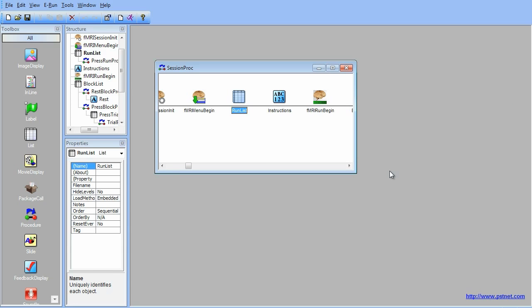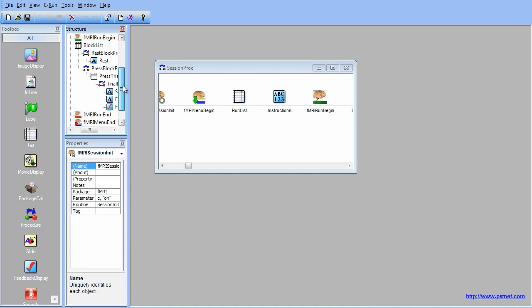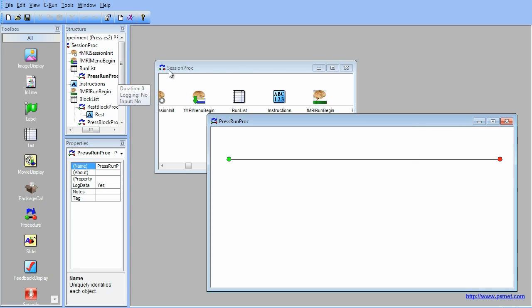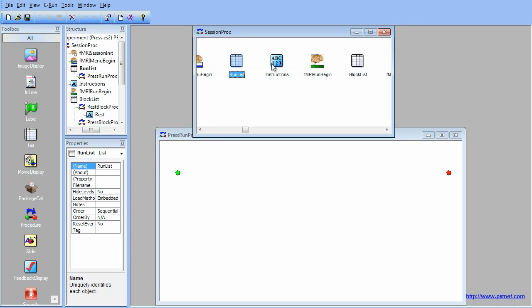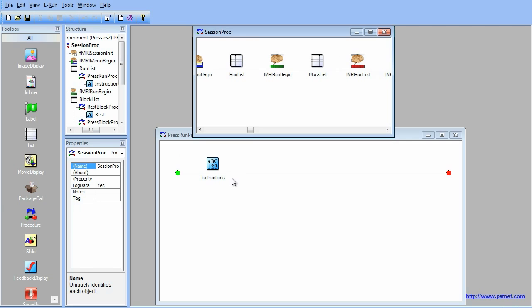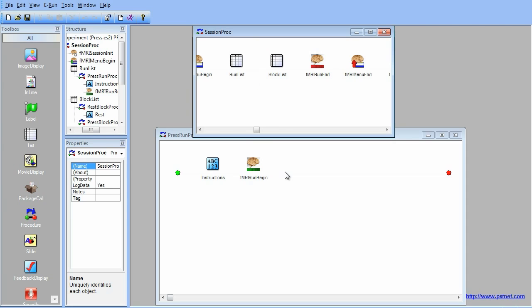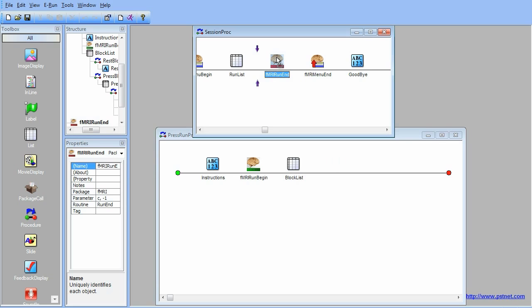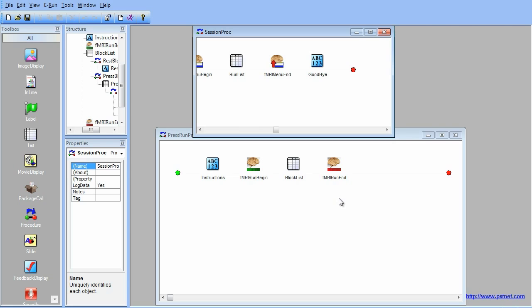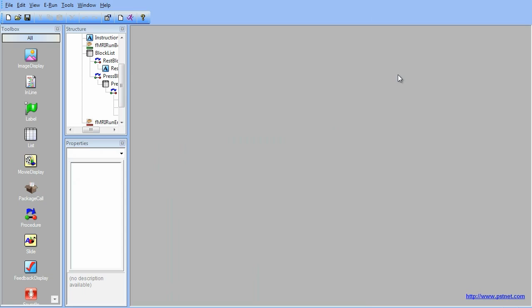Now that a new procedure has been created that the menu will draw from, the new procedure needs to be populated. Open Press Run Proc and place it directly under the Session Proc in the workspace. While holding the Shift key, drag the Instructions text object, the fMRI Run Begin package call, the Block List, and fMRI Run End from the Session Proc to Press Run Proc. And there you have it — that is how you add ePrime extensions for fMRI package calls to any experiment.